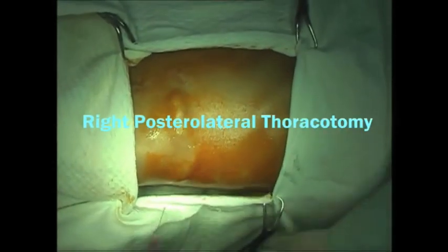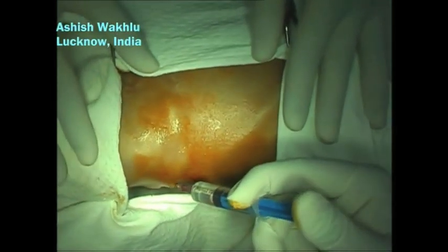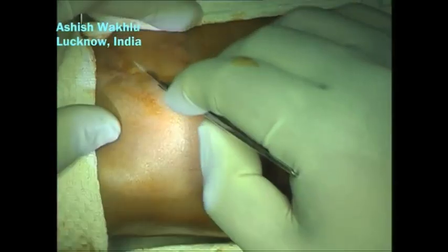Once the discontinuity of the right bronchus was established, the lesion was approached through a right posterolateral thoracotomy, entering the chest through the third intercostal space.